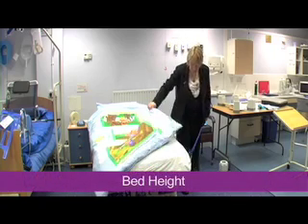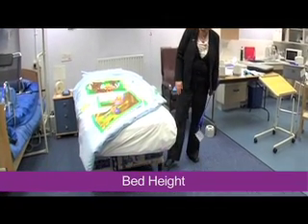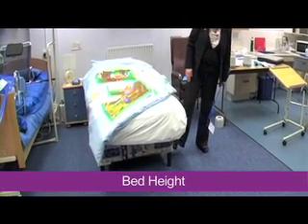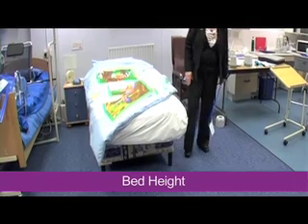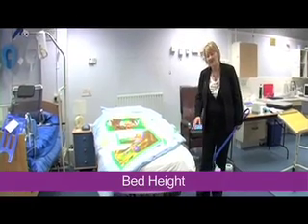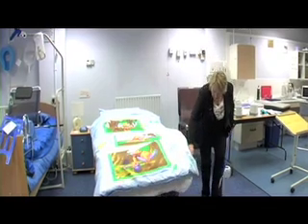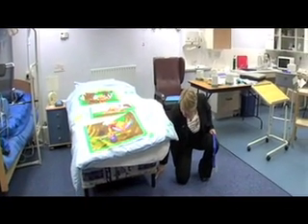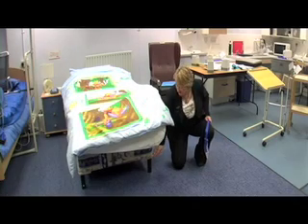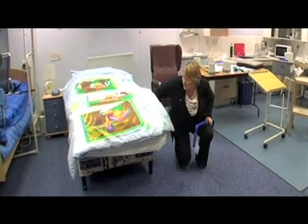But on the whole, the problem with beds is often that the bed is too low. This bed has actually been raised, and these are called St Helier raisers. So the caster has been removed. We've got a triangular block put in there, and we've got two little raisers. So this has been raised particularly for a reason, to enable us to get a hoist underneath this bed. But often you would do, this is 75 mils and another 75 mils, and that would enable a hoist to go underneath. But generally you'd only need to raise a bed about 100 mil, 4 inches.